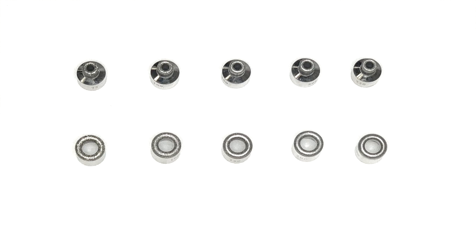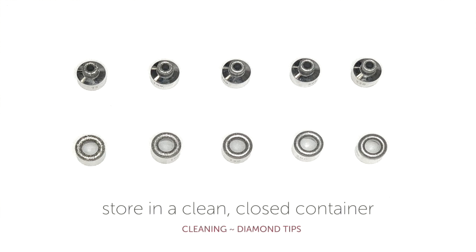Once tips are dry, store them in an airtight container, ready for use.